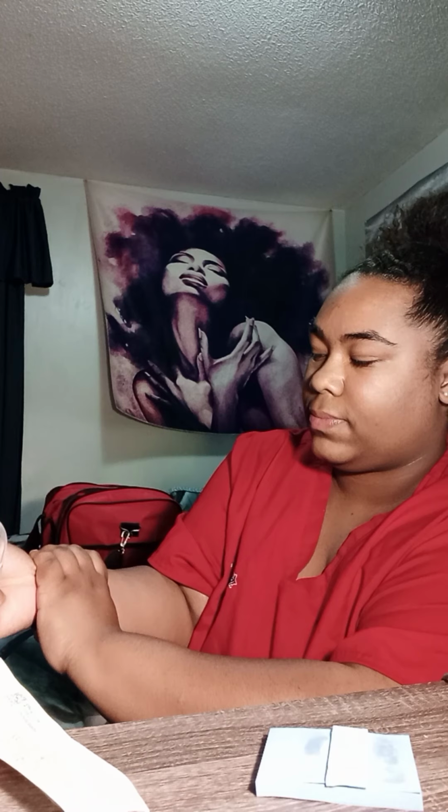I would have his arm like this, and then I'm going to make sure that it's 3 to 4 fingers down from the antecubital space, and then a full grip for the wrist. Okay, so I'm going to scan my medication right before I give it to him, going into the MAR. I'm going to open the package. I'm going to double check that it's at 5 units, which it is.